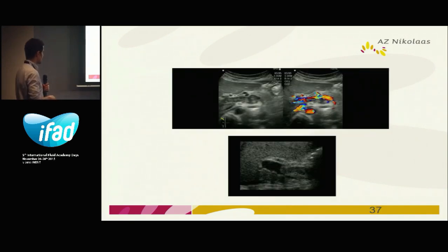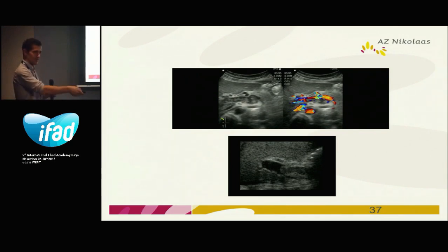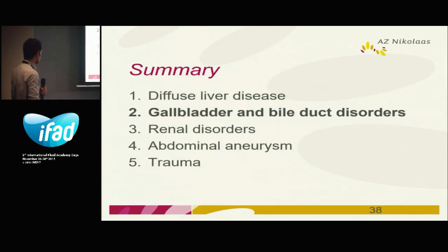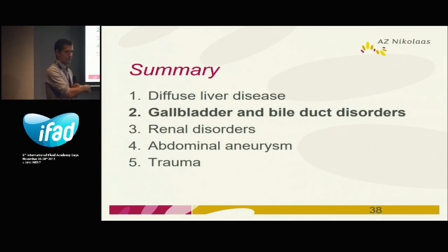Once again — once you've seen it, you will recognize it immediately. Here, this is the portal vein and here the thrombus is lying in the portal vein. This covers liver disease — let's go to gallbladder disorders.